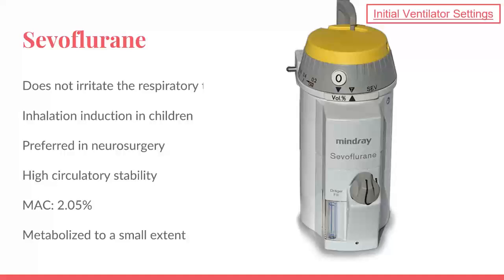Unfortunately, it can release toxic fluorides. These fluorides are nephrotoxic. An example is compound A. Compound A is another substance resulting from reaction within the system related to sevoflurane. When sevoflurane reacts with the lime in the carbon dioxide absorber, it produces compound A, which is nephrotoxic.